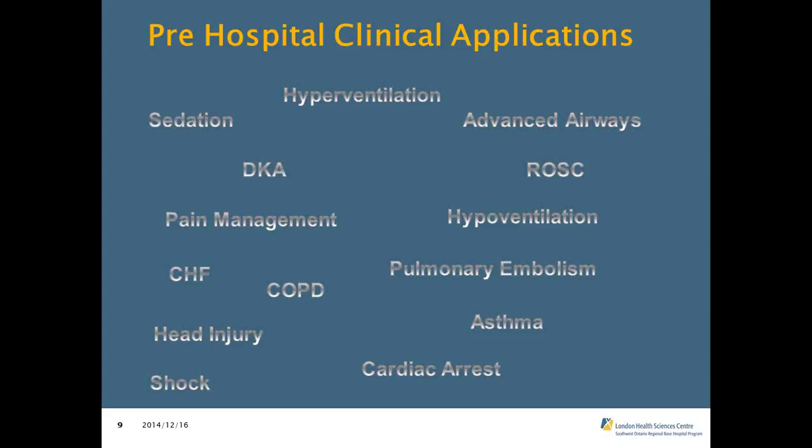In fact, a lot of the time with these other things going on, there are so many little variables that it's not the most specific or sensitive test for diagnosing these illnesses. So again, just remember that capnography is a piece of the puzzle that you use with your history, your physical, your other vital signs, and your clinical assessments to determine what is going on and how your treatments are affecting the patient.